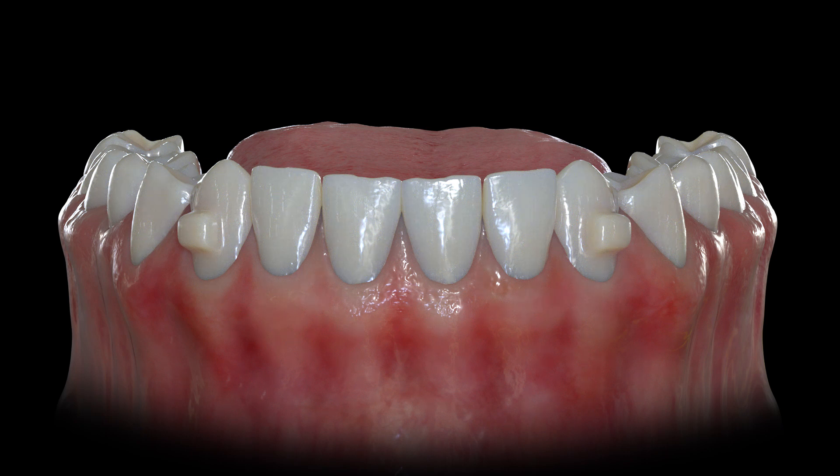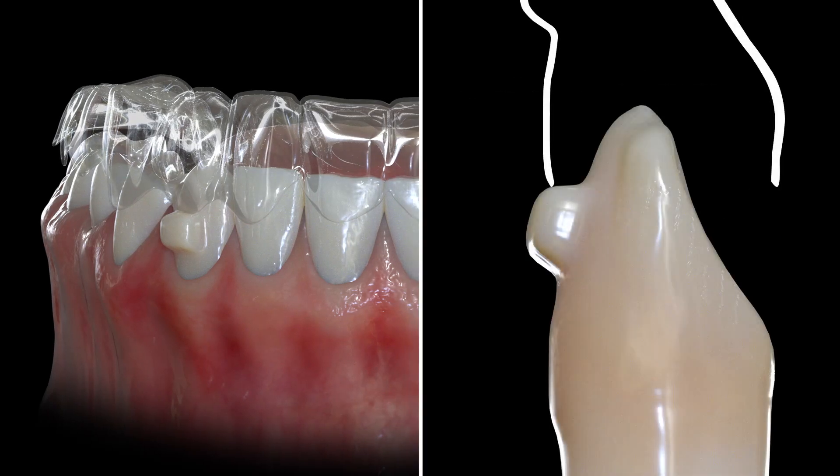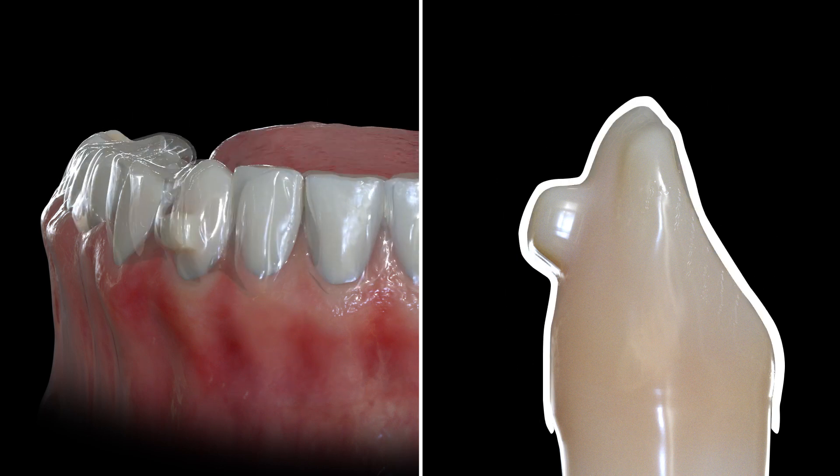Finally, buttons can also be used simply to aid in tray retention and tactile feedback for when they are seated. Patients with short clinical crowns can benefit from this. In particular, as the tray slides over the buttons, the patient will feel it snap into place, ensuring the best possible tooth movement tracking.